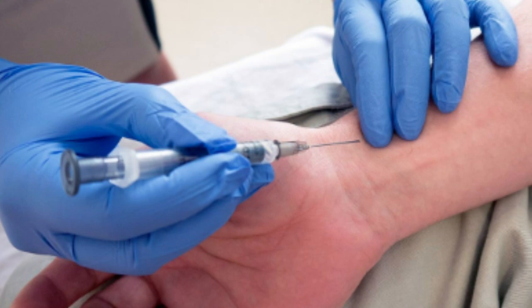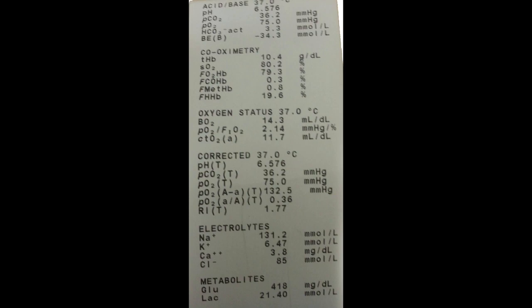So let's dive in. After you put your blood sample in the analyzer, you'll get a printout of the results that will look a bit like this. Now if you're new to ABGs, this might seem daunting as there's over 20 results on the printout, but don't despair. The blood gases are actually just these top 5 results, and this is what we're going to teach you about in this video.